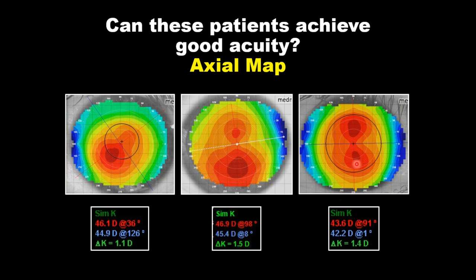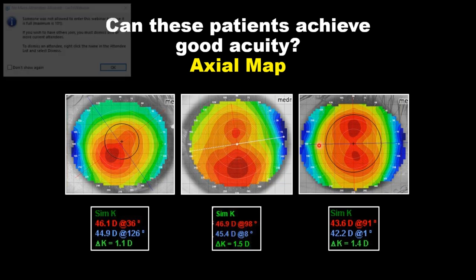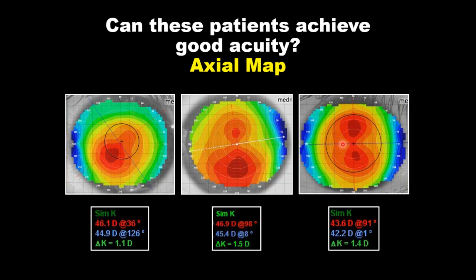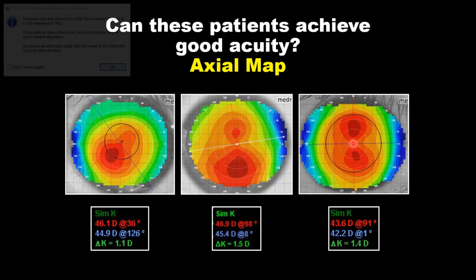If we look at this patient, we see that one hemisphere — if we cut the eye in half — the upper half and lower half are like a mirror of each other. Same with nasal and temporal. So this eye is really very symmetric and should respond very well to sphero-cylinder refraction.